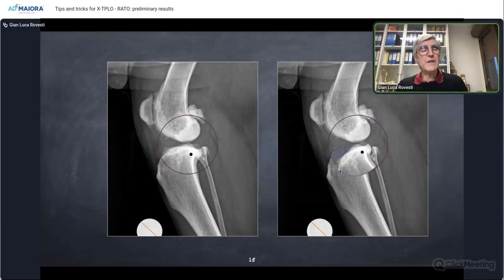So how did we manage this kind of issue for many years? Just releasing the jig. We were not able to rotate the tibia in a smooth way, so we released the jig, and the jig was no longer able to counteract this rotation. But the question at this point is, how should we use the jig if we release it and if it's no longer the center of rotation of the osteotomized tibia?